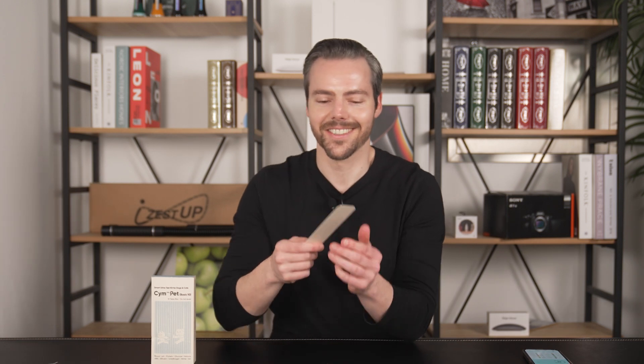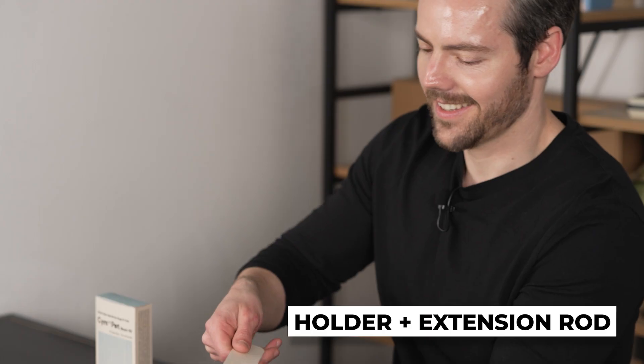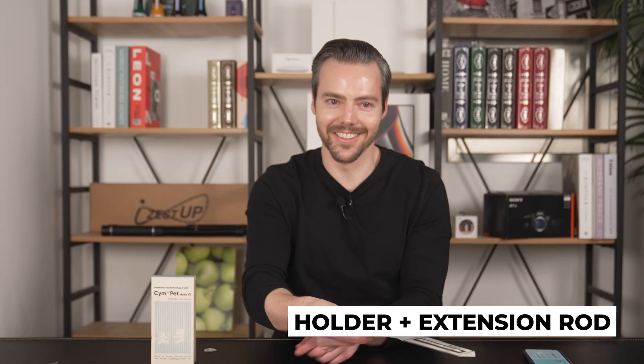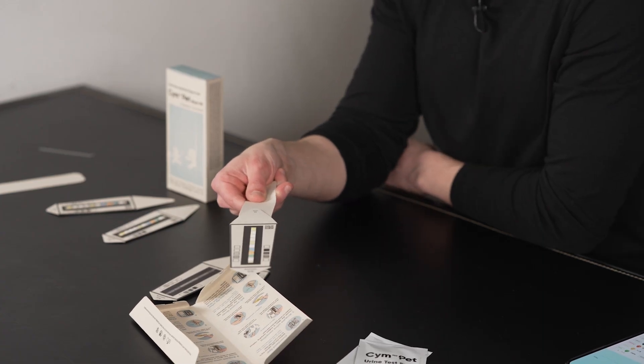Oh, and there's also this handy little extension rod. You take off the sticker here and attach it to the boat, and then you can get your sample from a longer distance without getting it on your hand. So that's pretty nice.